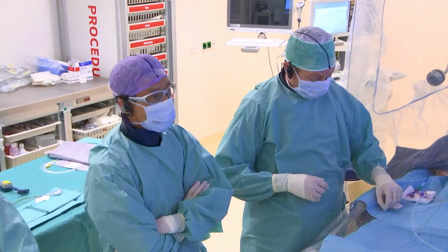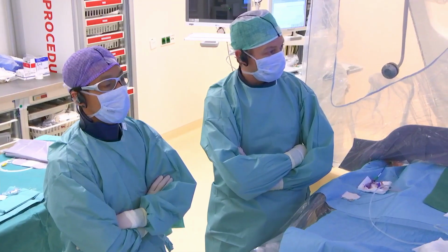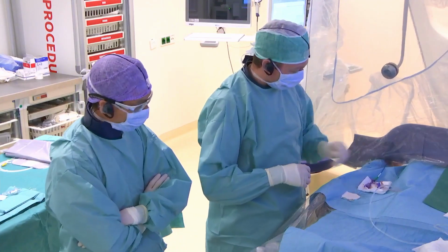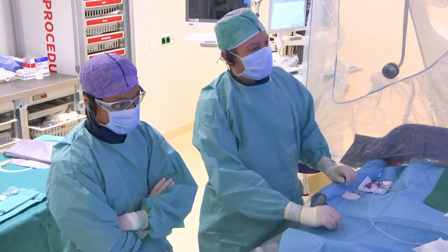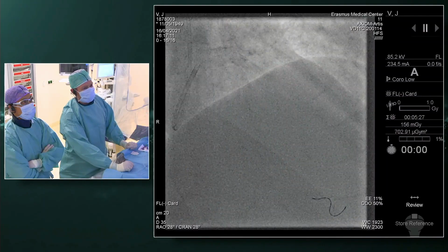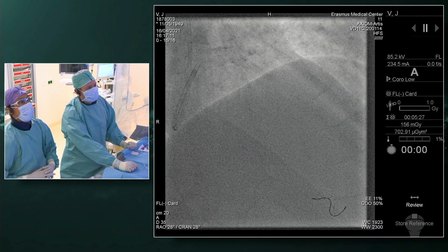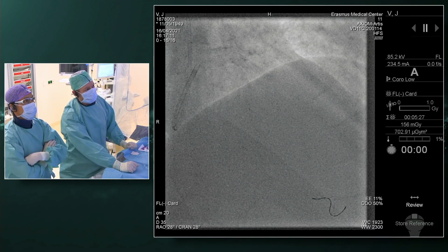Excellent. So what we did is we started again with an EBU 3.75 with a right radial approach, 6 French. We made a few angios, and what I quickly want to show you, for those who wonder whether the LAD is calcified but significant, is an angio-based FFR, and Martin maybe can quickly show that to you.